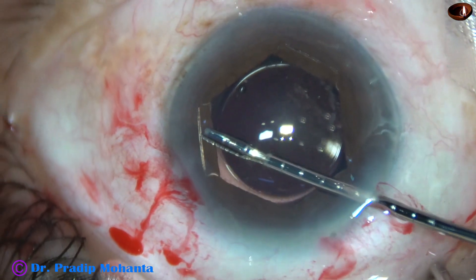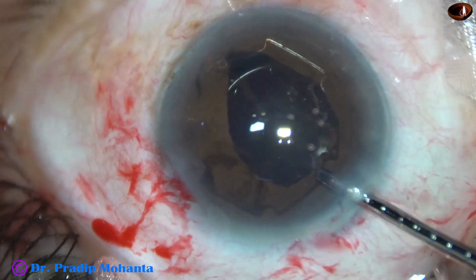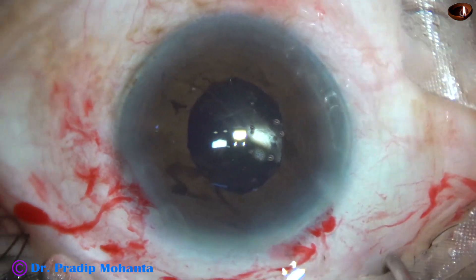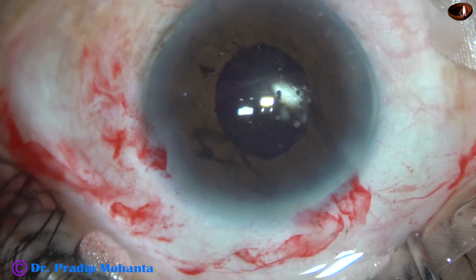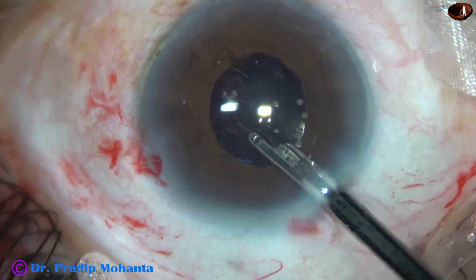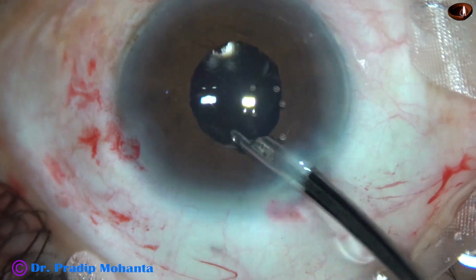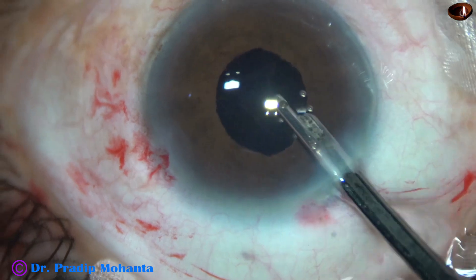Now we are going to remove the B-hex. One flange which is above the iris is held, and it is manipulated in such a way that the other flanges are untucked, and it is just pulled out. There is some pigment dispersion — we have to remove these pigments. We have to remove the viscoelastic very nicely so that the intraocular pressure remains normal. There should not be any rise of intraocular pressure because of retained viscoelastic substance.